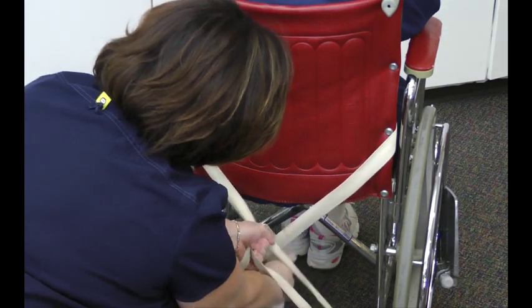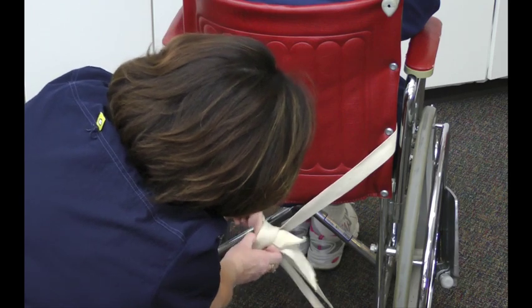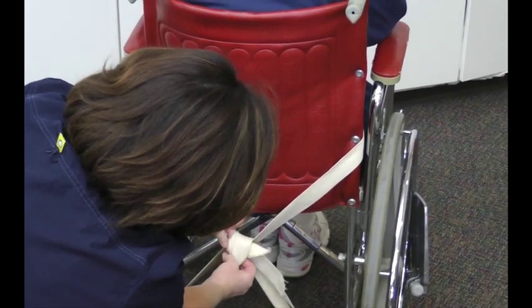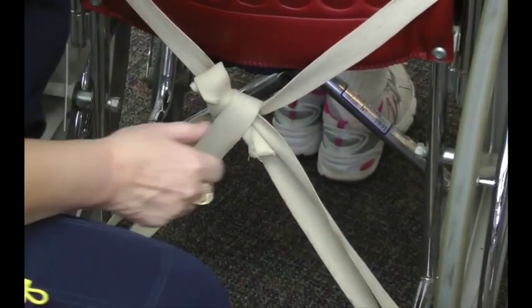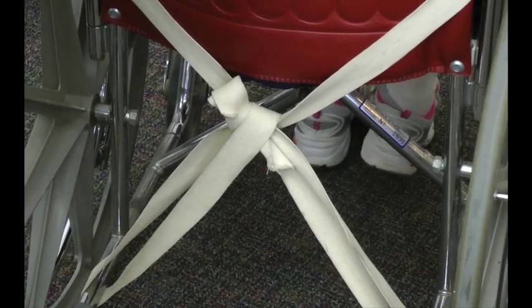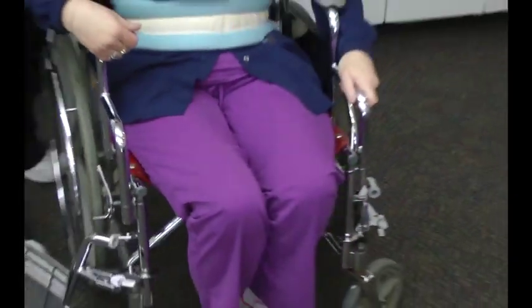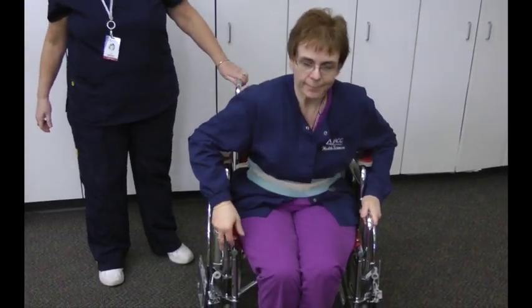You're gonna have to practice with this a little bit, but a slip knot is something that can be pulled with one finger. Okay, and that's how the restraint needs to go. I want Melissa to turn back around so you can see how it fits right on her waist here. Okay, Melissa, can you lean forward a little bit? Yep. And that's what it's to do.